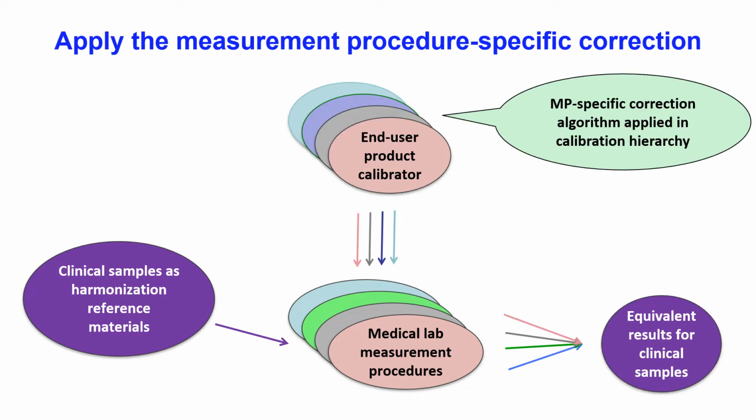The next requirement is to apply the measurement procedure-specific correction and confirm that it does in fact produce equivalent results for clinical samples for the harmonization reference materials.